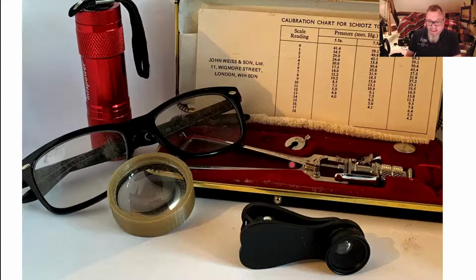However, today's really about imaging, and although we have all these fantastic, fancy pieces of equipment that allow us to do amazing things, for most of what I do nowadays in terms of diagnostics, I need my reading glasses, particularly as I get older, and some sort of focal light source. That could be a simple pen torch or the light on my phone, an indirect lens, a magnifying lens to put onto my smartphone, and something as simple as a Schiotz tonometer to measure pressure. With these simple pieces of equipment, we can do most of our diagnostics.